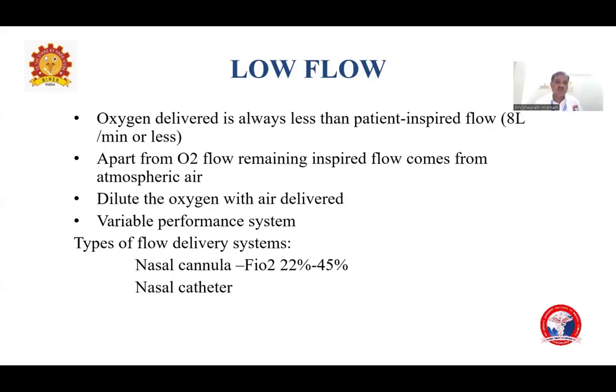Apart from the oxygen flow, the remaining inspired flow comes from atmospheric air, and this dilutes the oxygen. So the device acts as a variable performance system.